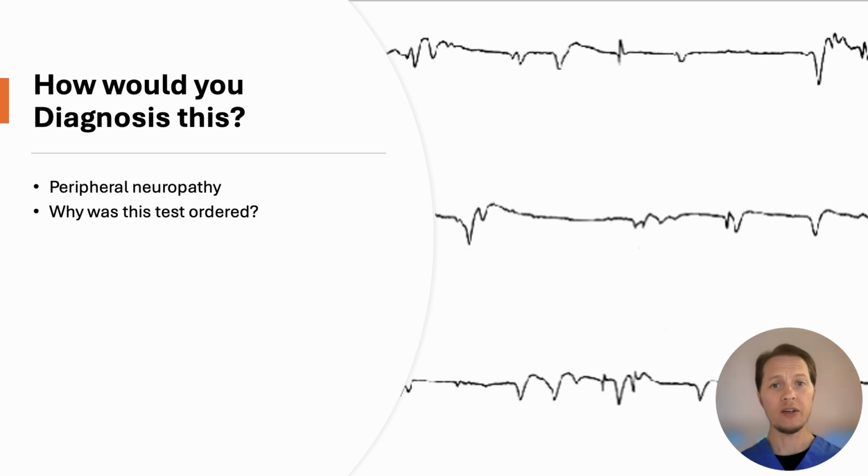And so how would we diagnose this? Well, I'll give it to you. Yeah, it's neuropathy, and a pretty bad neuropathy, I would say. Axonal, yes. Demyelinating, yeah, but I'd say axonal is certainly the predominant feature. Sensory, yes, but also motor.